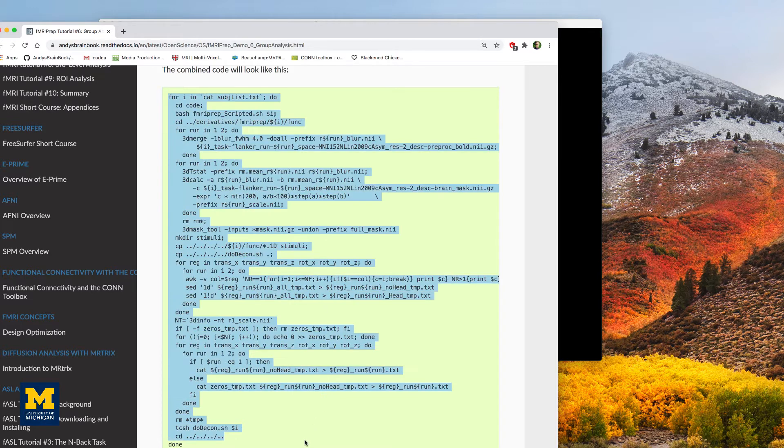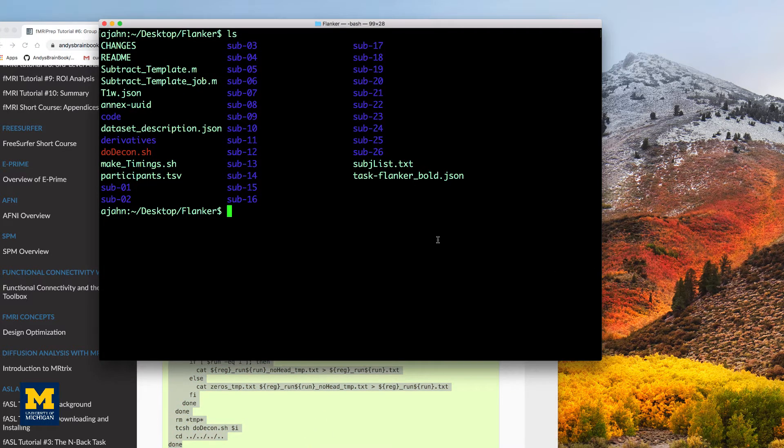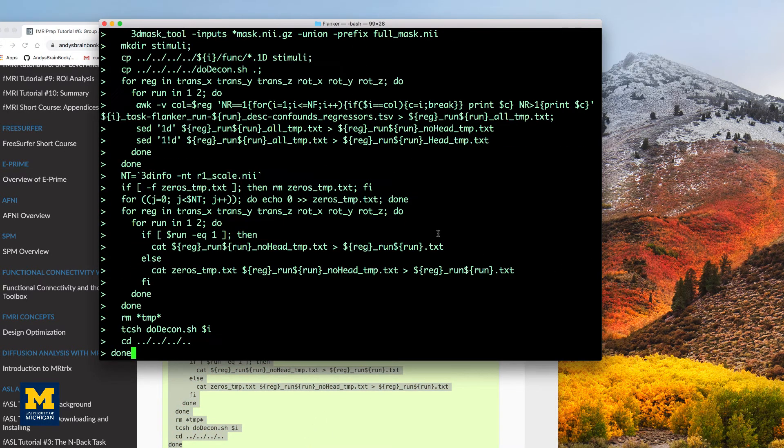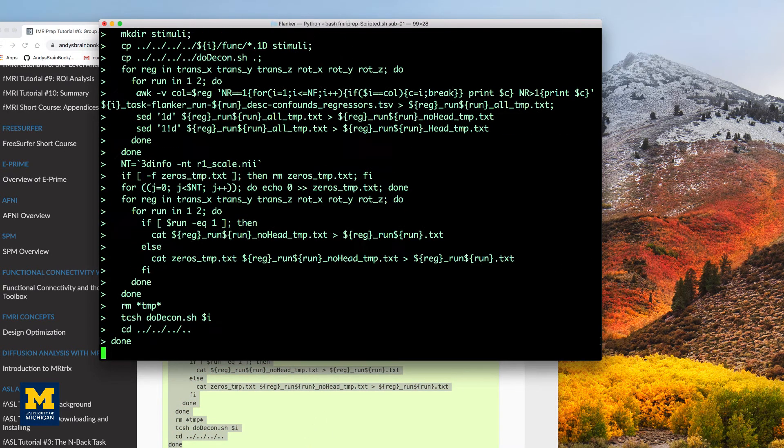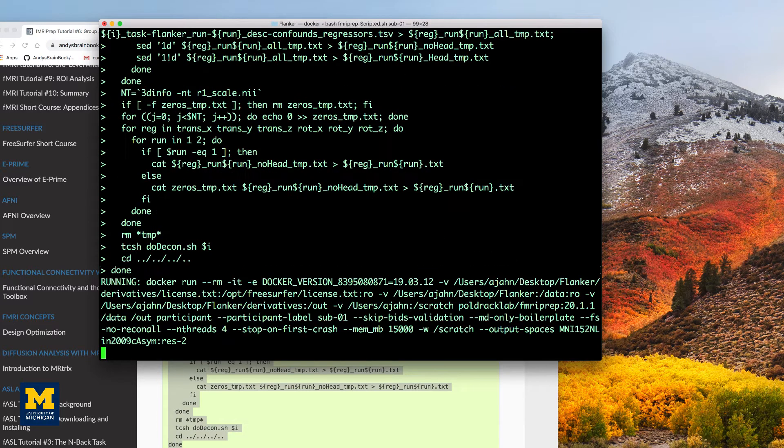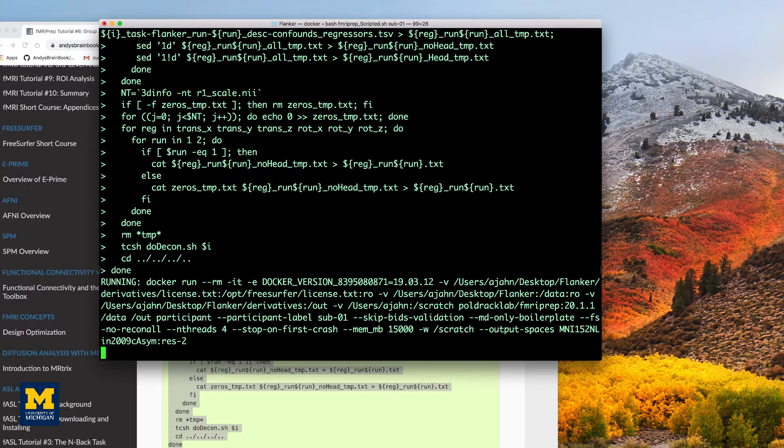Again, making sure to run it from the Flanker directory. This will take a long time to run, maybe a few days, depending on the speed of your computer. So I'm going to fade out now.